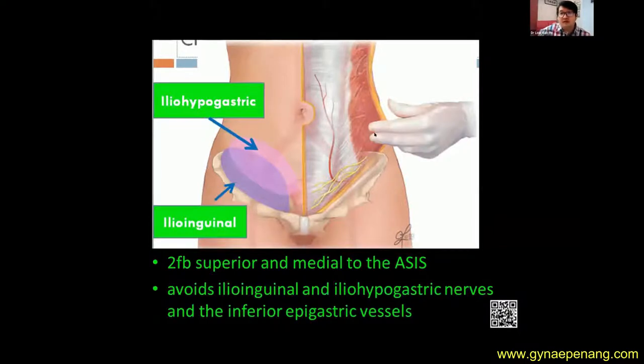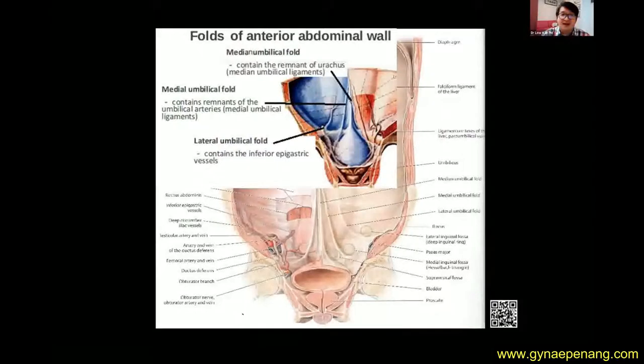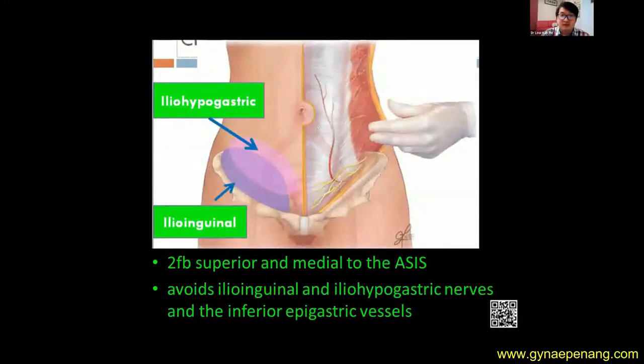No matter how fat you are, you can feel the bony structure at the pelvis there. For me, I also use a golden rule of 1/3 of the way from the ASIS to the umbilicus. This area is usually the ancillary port. I think this port insertion will be covered in more detail by Prof. Aizura. This one is from outside.